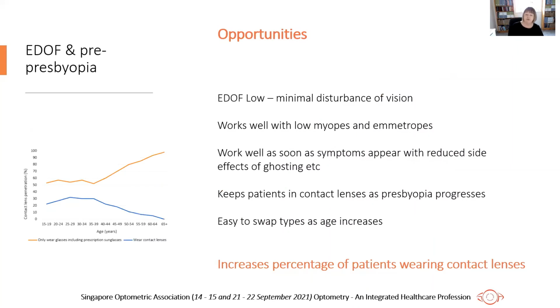So what are the opportunities with EDOF? Well, because it provides minimal disturbance of vision and works really well with low myopes and emmetropes, because it doesn't really cause blurring in the distance in the low, it's very easy to put these patients in these lenses without them really noticing anything. You're not compromising their vision in terms of simultaneous vision with a multifocal.